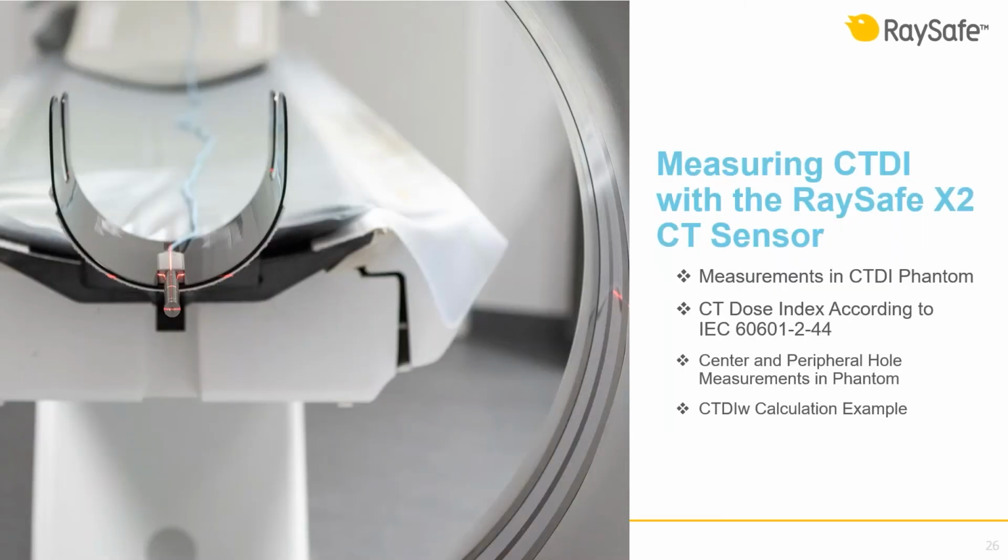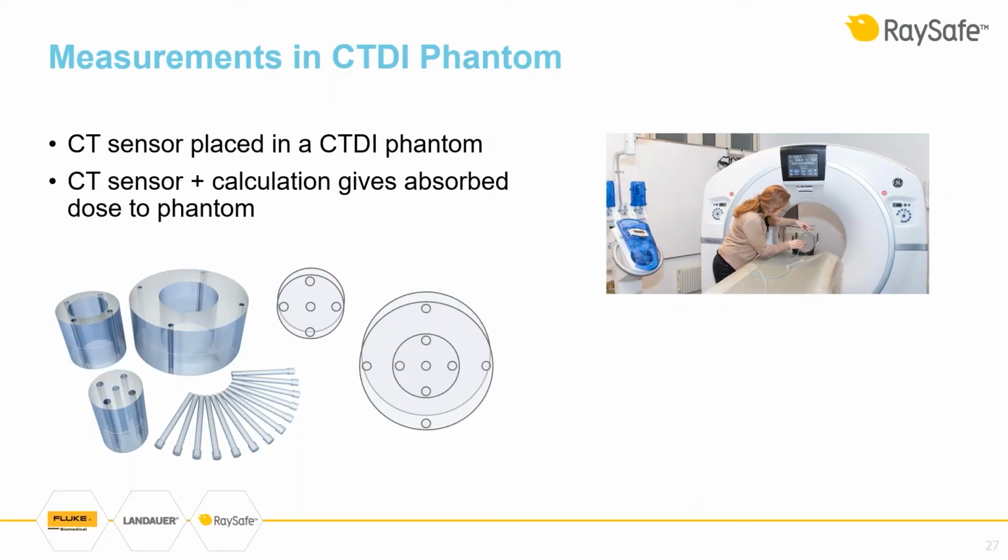We will now leave the measurements free in air and continue with one of the main topics for the day, the CTDI measurement, using the RaySafe X2 CT sensor. On the picture, one can see an example of a CTDI phantom used for measurements and CTDI calculations.